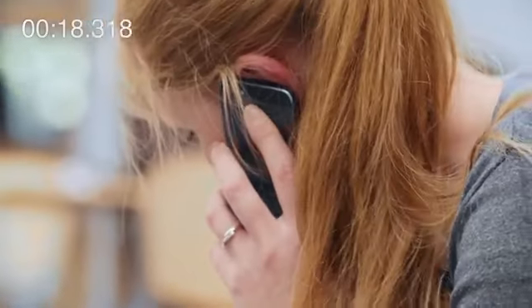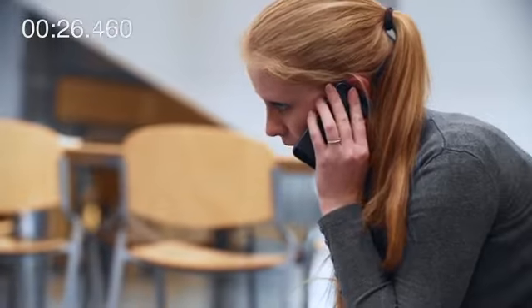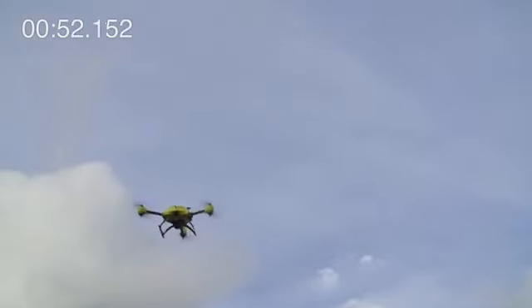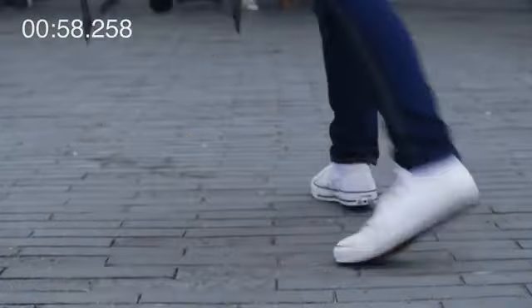Remove his top shirt to uncover his torso. Okay. Great. Can you go to the nearest exit? The ambulance drone is almost there. Okay. I'm outside. I'll be talking through the drone now, so you can put down the phone. Now please pick up the drone and bring it to your father. You're doing great.